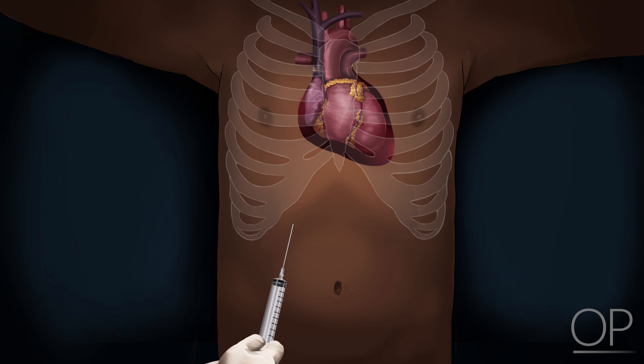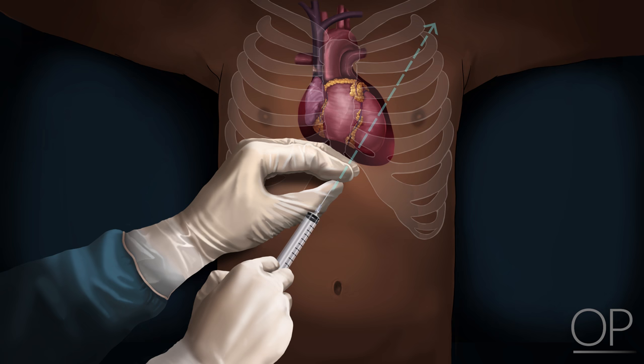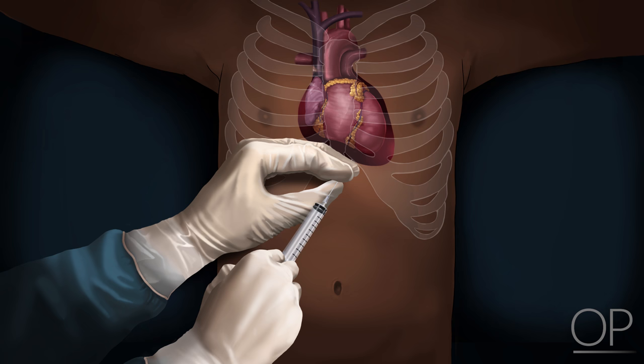Insert the spinal needle in the subxiphoid region between the xiphoid process and the left inferior costal margin. Angle the needle underneath the ribcage no more than 45 degrees to the patient's skin, and aim the needle towards the patient's left shoulder as you continuously aspirate the syringe. Short, quick jabs, as opposed to slowly advancing the needle, are required in order to penetrate the parietal pericardium and to not tent it against the visceral pericardium. Advance and aspirate the needle until fluid, blood, and/or air is obtained.